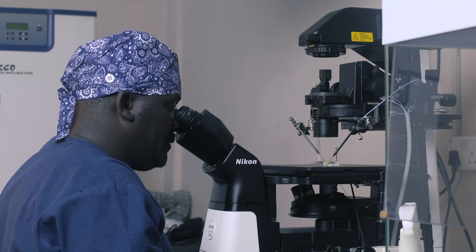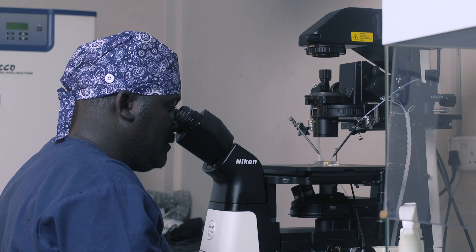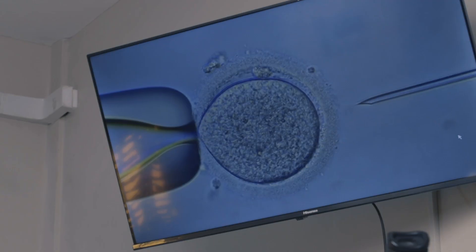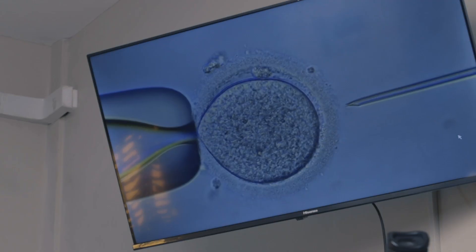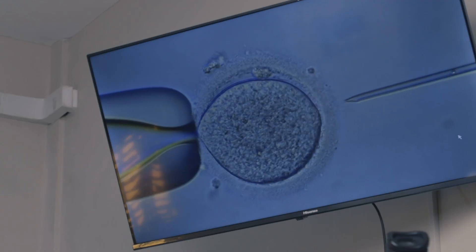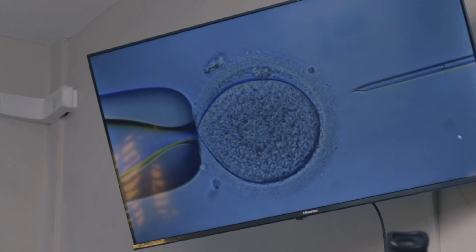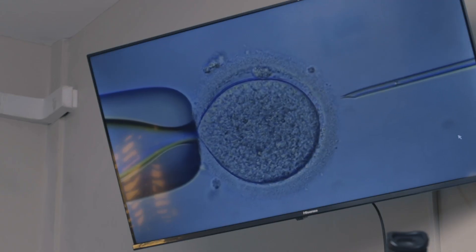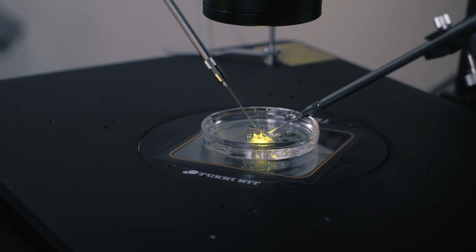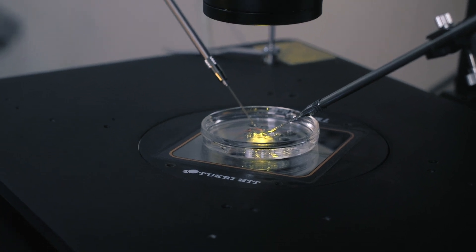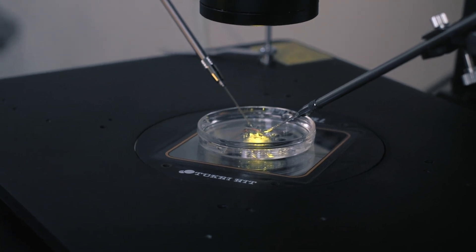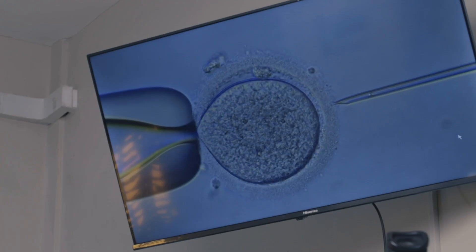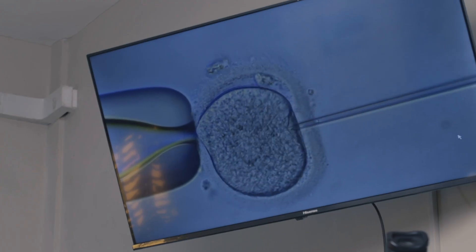I have a sperm there, I have my egg in position, and I have my sperm at the tip of the needle. I'm going to inject it into the egg.